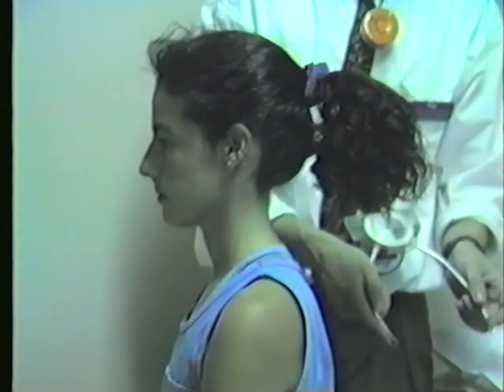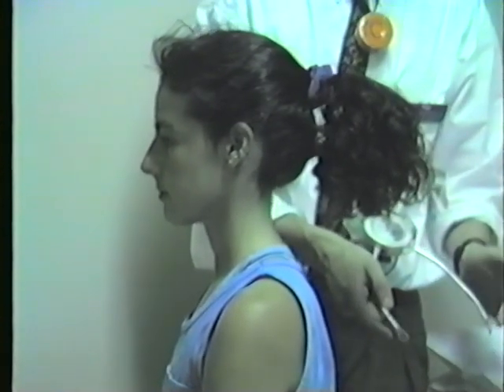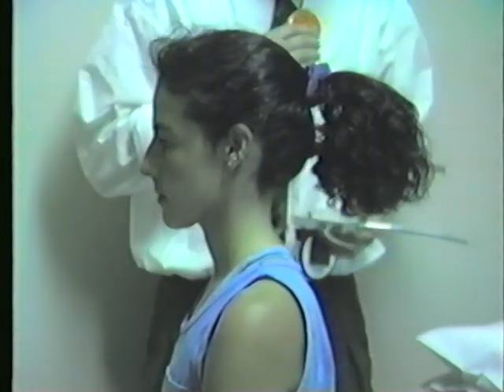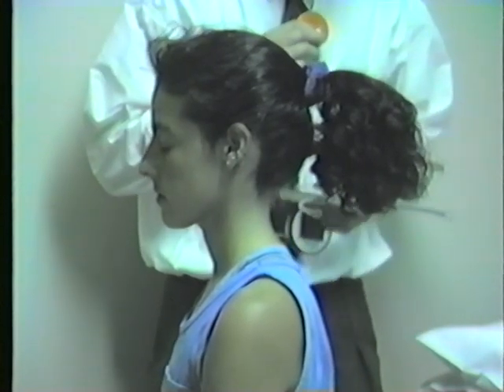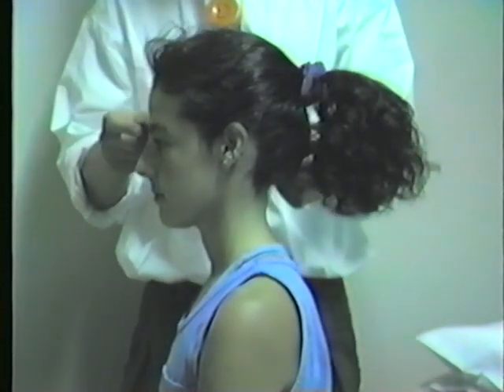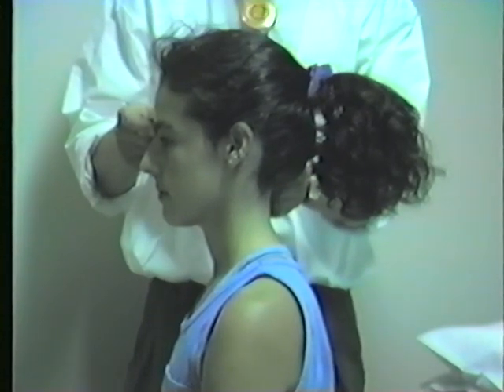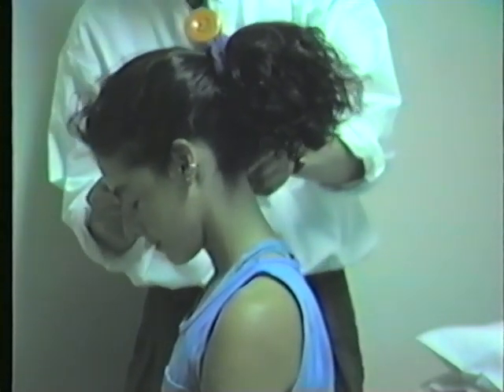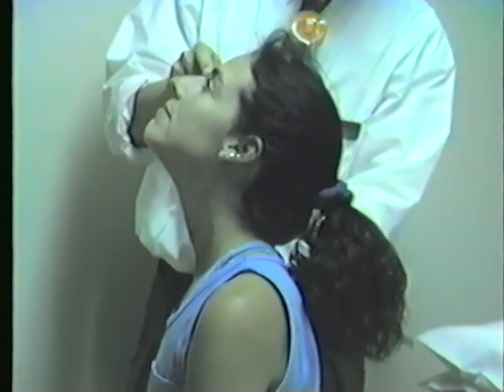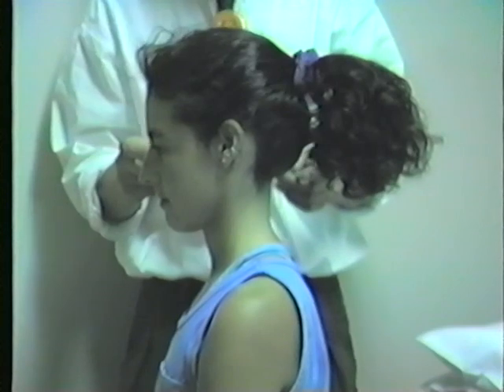First application: I'm going to measure cervical forward bending and backward bending. I attach the palpation ends to the tool now, and I'm going to contact the nasion and the spinous process of C2. I'll bring the tool to the right level — about here — and contact the nasion and the spinous process of C2. And now Cheryl is going to bend forward and backward. Both measurements are shown on the inclinometer of the tool while she does this.